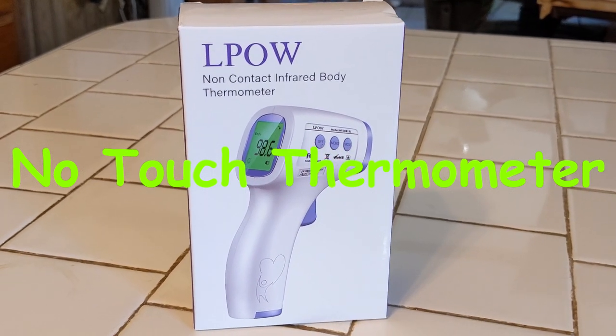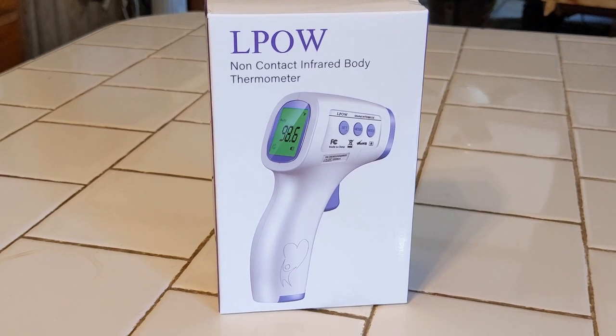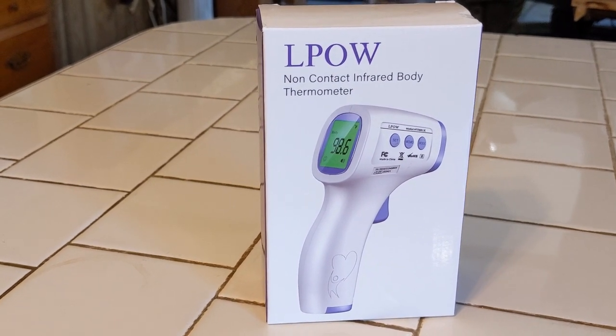All right, today I want to do a review. It's the L-POW. It's a thermometer. This is a no-contact infrared body thermometer.